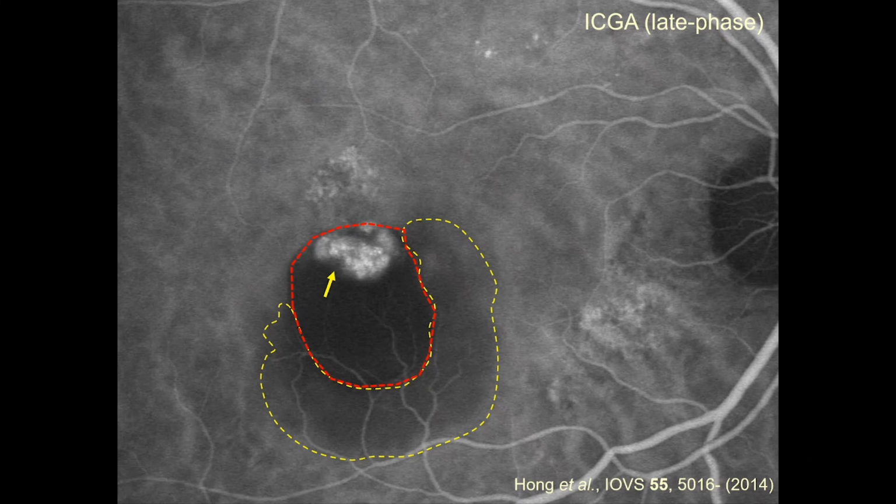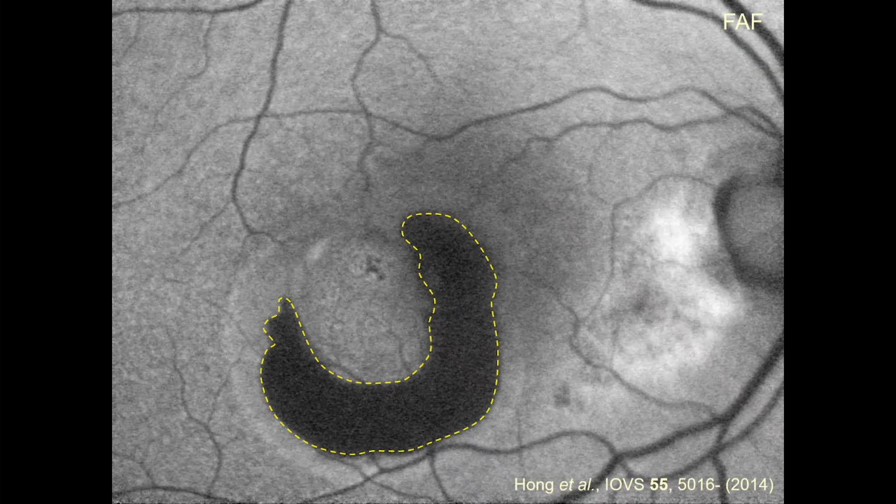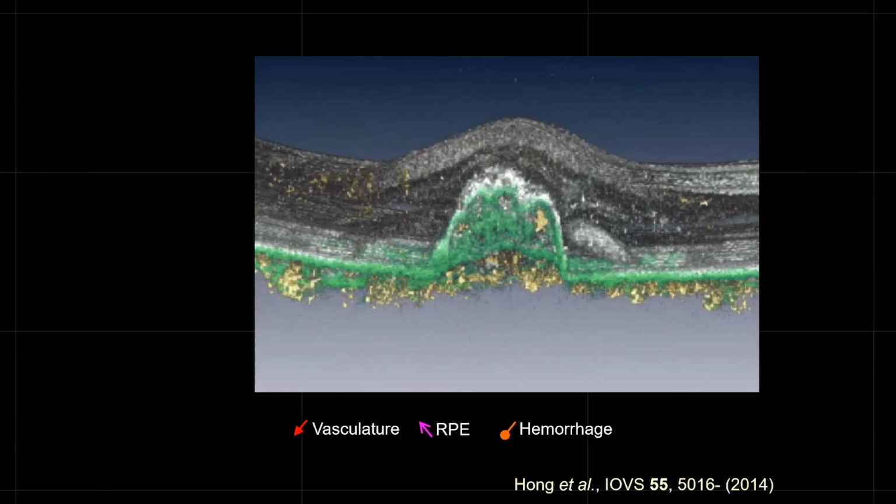Then, checking this eye using fundus autofluorescence imaging, we see the absence of the retinal pigment epithelium, RPE damage. So my question is whether the information obtained by these three types of conventional devices, even one of which was an invasive method, can be obtained by a single scan of the Jones matrix OCT. And surely the answer is yes.